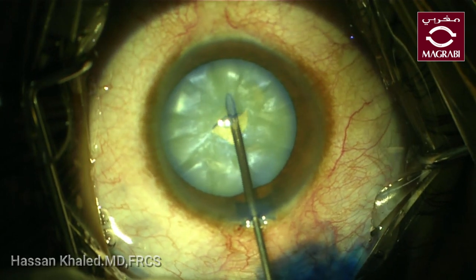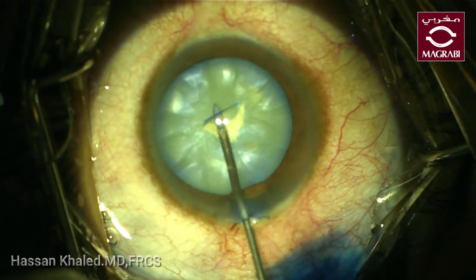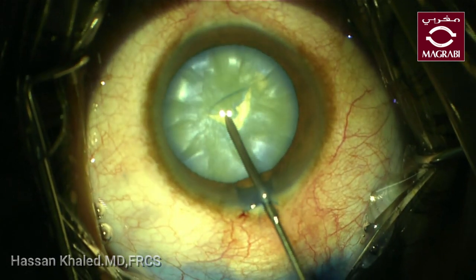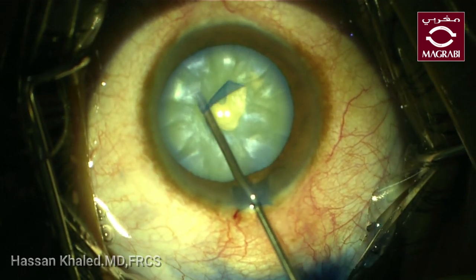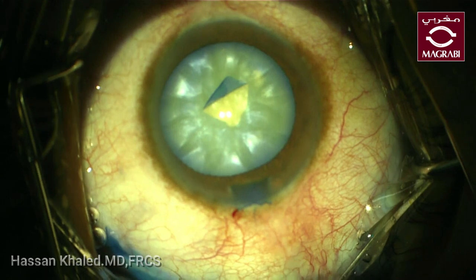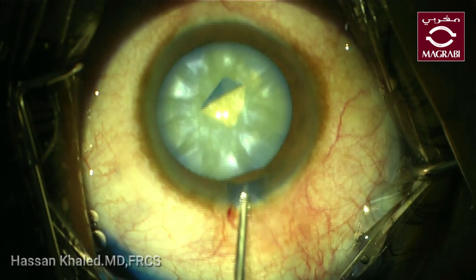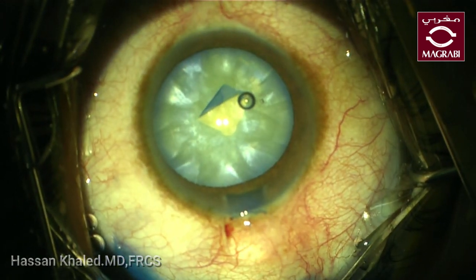You can see here, after staining the anterior capsule, using a 25-gauge needle connected to the aspiration tube of the phaco machine, then using this needle to aspirate the milky fluid. Note that the needle was used in the wrong way with the bevel up — the bevel should be down while doing aspiration with this needle.